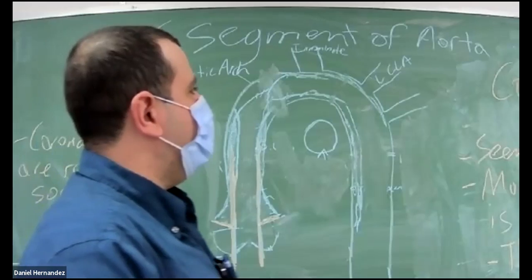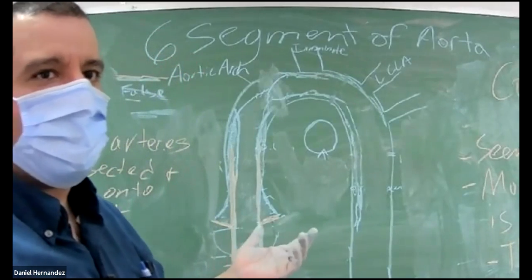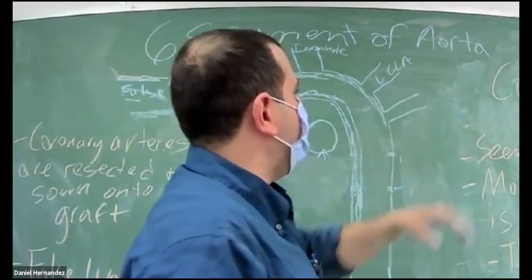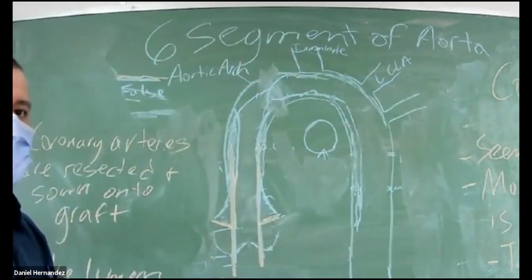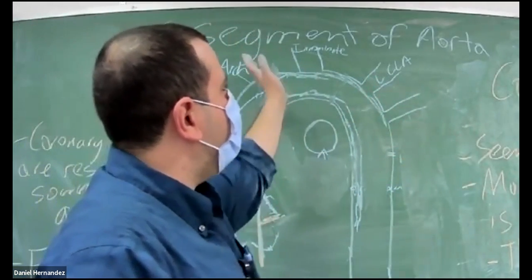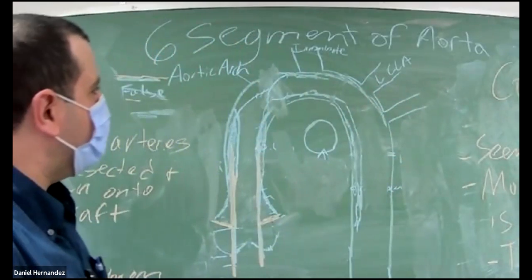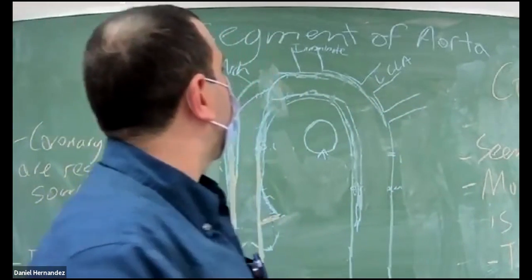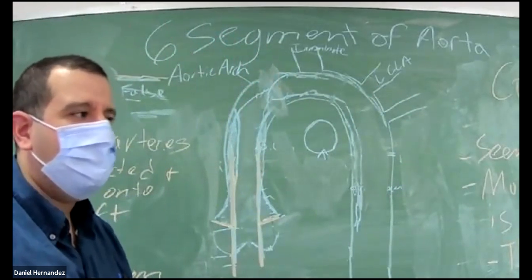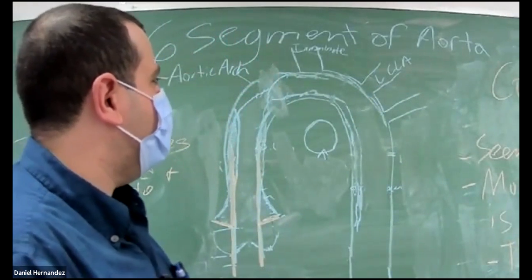If you're imaging the carotid arteries, you'll see reduced flow within the common carotid, ICA, ECA, whereas the right side velocities would appear normal. As we know, coarctation also increases our afterload. It's a pressure overload, increasing pressures on the heart.